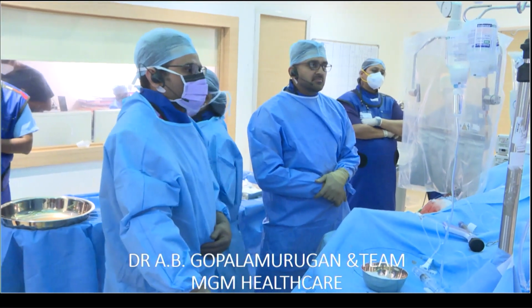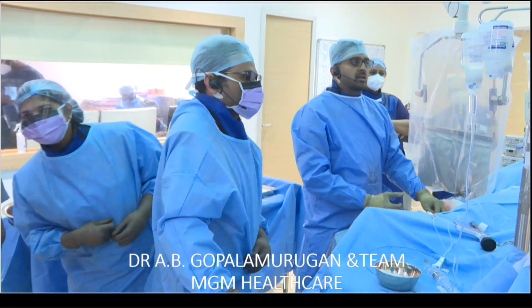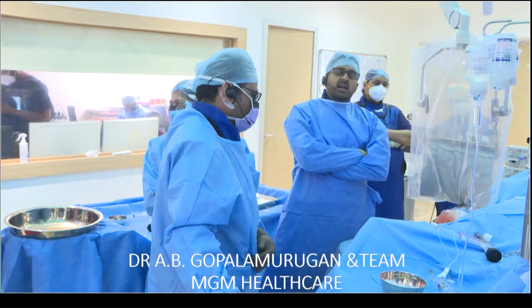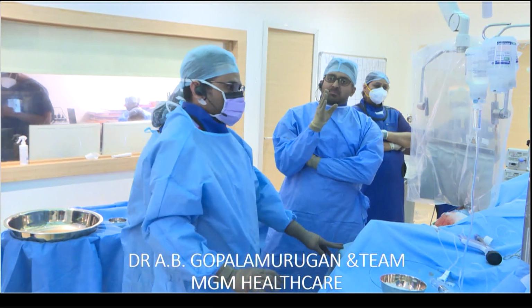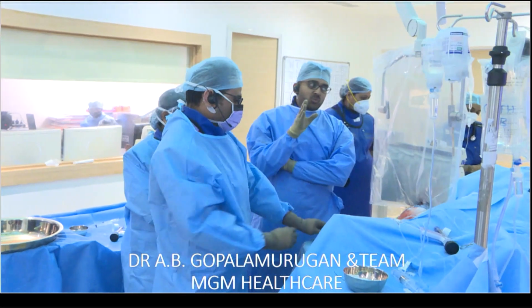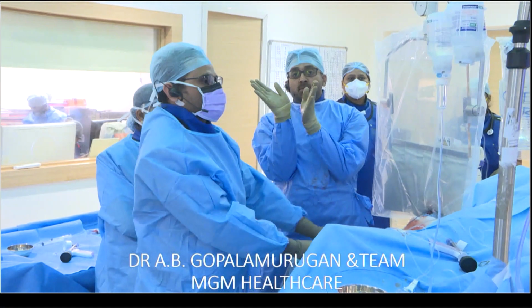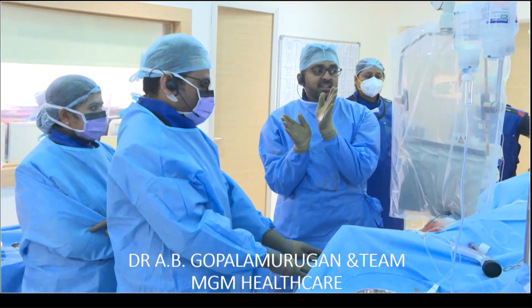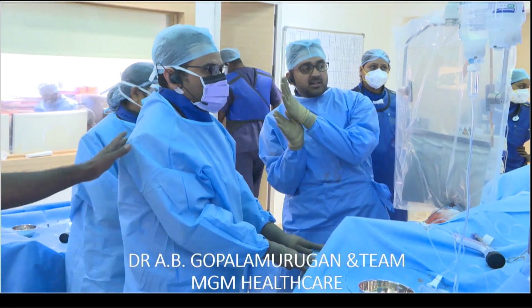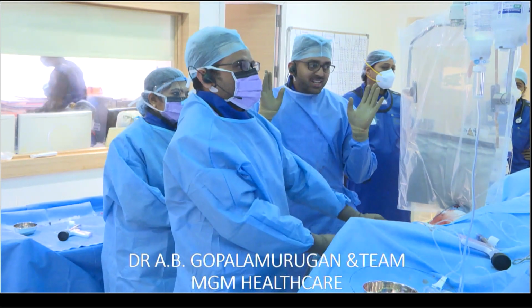One question, Gopal, what do you think, why the struts were there across the circumflex ostium despite the kissing initially? Was it undersizing of the side branch balloon, or what do you think? I think there was a lag between the release of the circumflex and the LAD balloon kiss, which may have pushed one or two stent struts on towards the circumflex, i.e. the circumflex balloon probably came down early, and the LAD balloon came down late, whereby pushing one or two struts across the circumflex ostium, which is the point of least resistance. That's my postulation, but I may well be wrong.